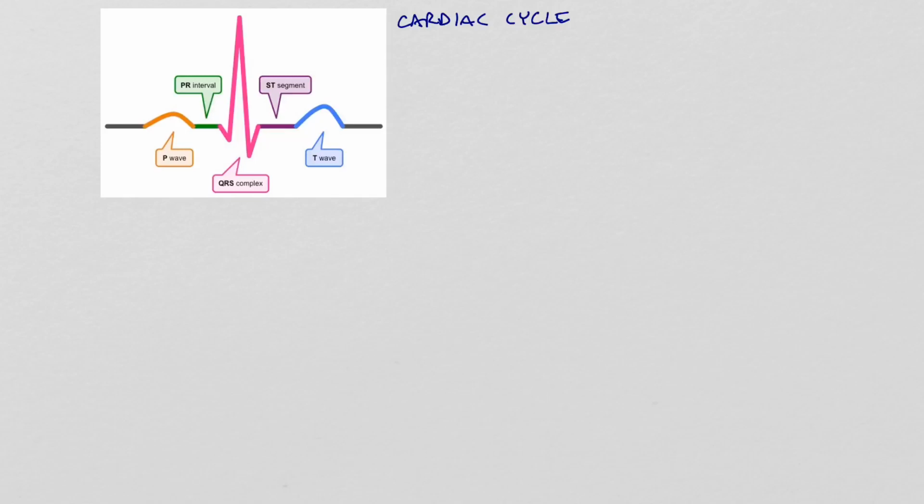And so this particular measurement that we see right here, this little graph, this little image, is called an ECG. Stands for electro, because it's measuring electrical activity, cardio, because it's talking about the heart, and gram.